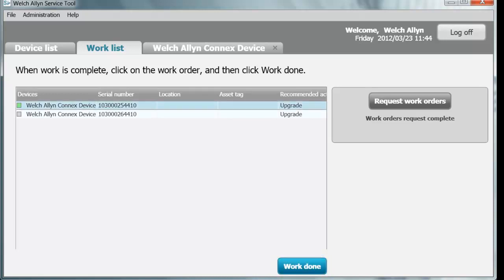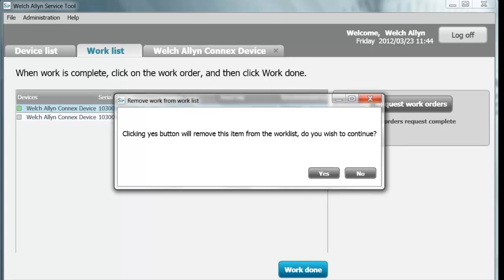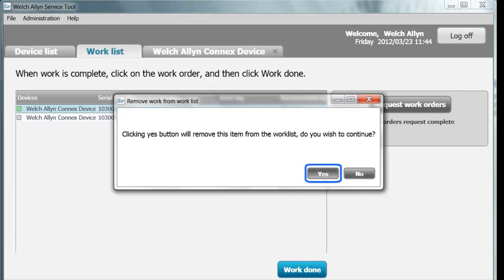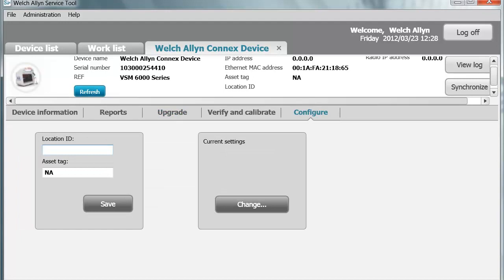Now back on the work list, highlight this device and click Work Done so the next person who comes into the service tool can see a real-time list. If one person installs an upgrade and puts the device back on the floor, the next person doesn't have to search for the device only to find the upgrade has already been installed. Going back to the device tab, Configure — this is where we can assign our location. Since this is at my desk, I will write 'desk.' The asset tag of this device is 123405.